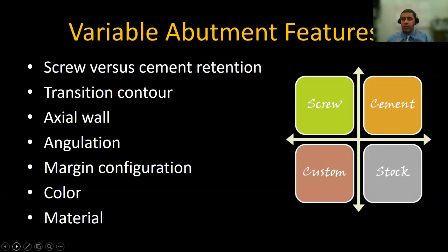What's the angulation of those implants and where is the screw axis located? That has to do with the implant placement and with the restoration that you are trying to accomplish, or what the desired feature of that restoration is. And nowadays with CAD/CAM technology, we can even redirect the implant angulation utilizing 5-axis milling and things like angulated screw axis or angulated screw channels to achieve a better aesthetic outcome, and still have the screw axis, for example, coming through the occlusal surface of the posterior teeth or the palatal surface of the maxillary anterior teeth.